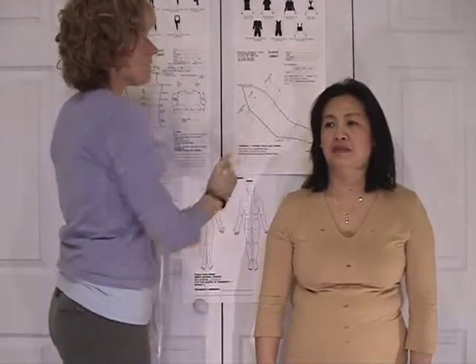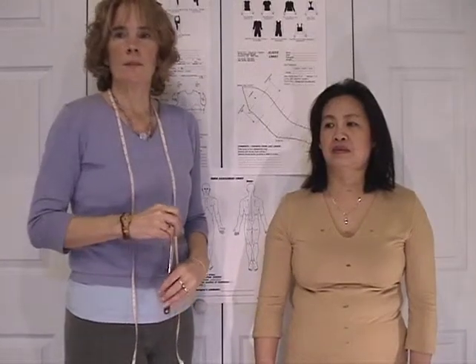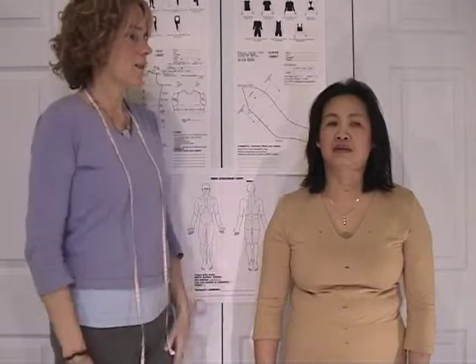One key thing when measuring a sleeve: you never want to end the garment mid-muscle. The garment needs to end distal or proximal to the muscle to help give proper anchorage. When you start to measure, circle right or left — we get a lot of mix-ups. Keep in mind that all the lengths you give us include the elastic, so you don't have to worry about that. Be sure the patient is standing with their arm straight and down at their side for the best measurements.